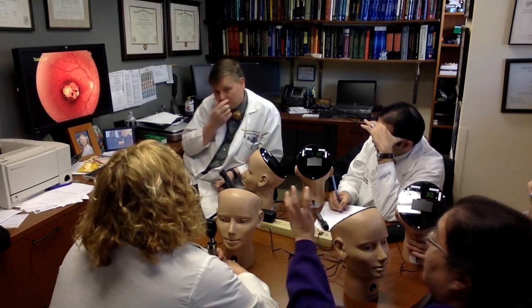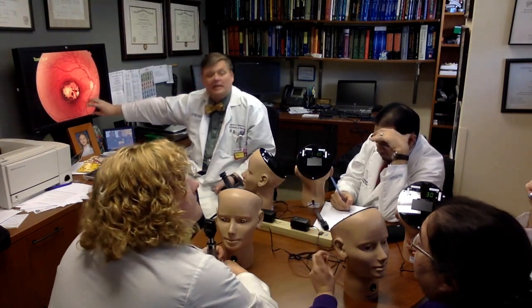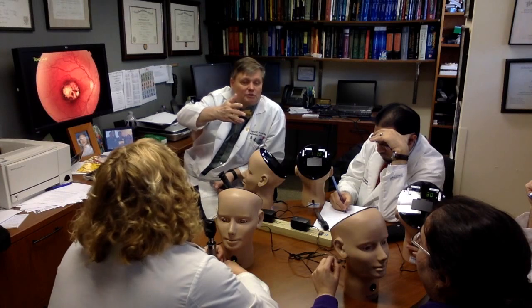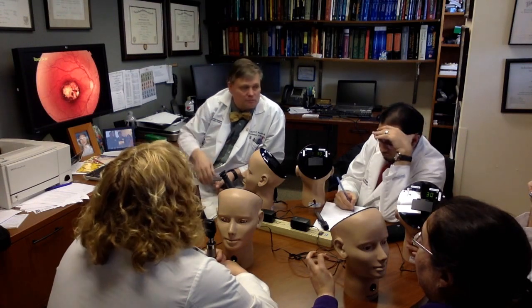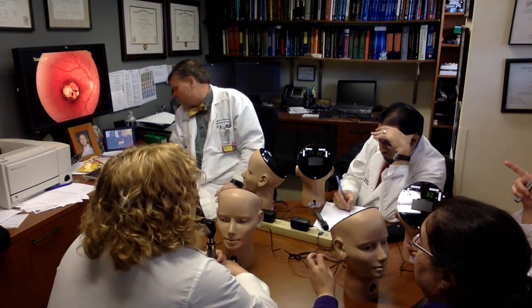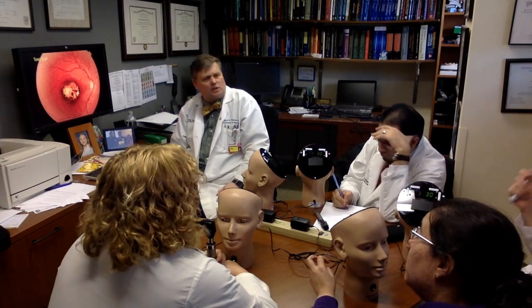So you're saying it could end up in any spot? Sure, but it will always have that appearance. Exactly. If you Google toxoplasmosis retina, go to the images, they all look the same. That's kind of a neat thing for pediatric neurology. What about the optic disc? Is it atrophy, or can it be or cannot? It all depends. It all depends, yeah.